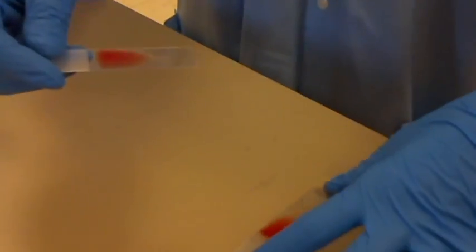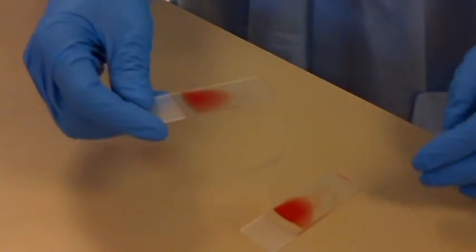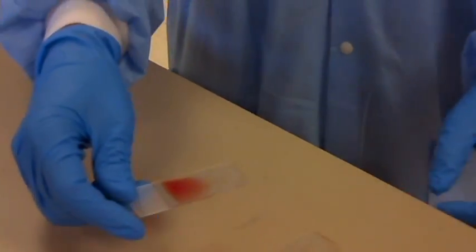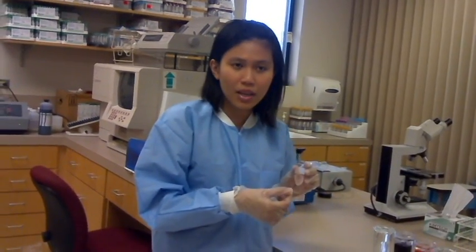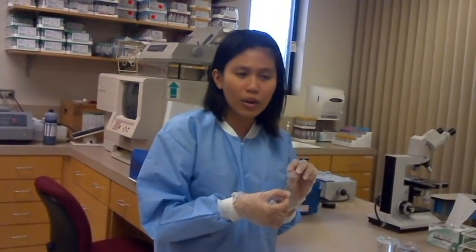Next, Hao is going to introduce how to stain this slide with dyes. Hi, my name is Hao. I will explain how to stain a smear. After you make a smear, you should let it air dry for about 4–5 minutes.